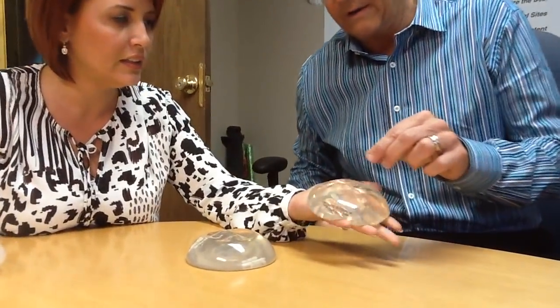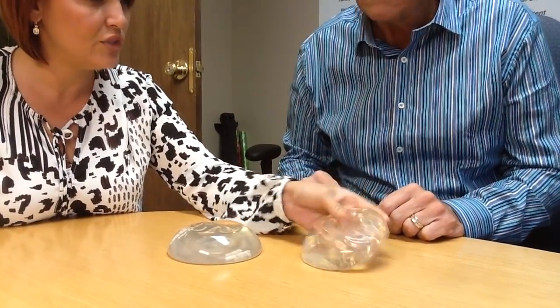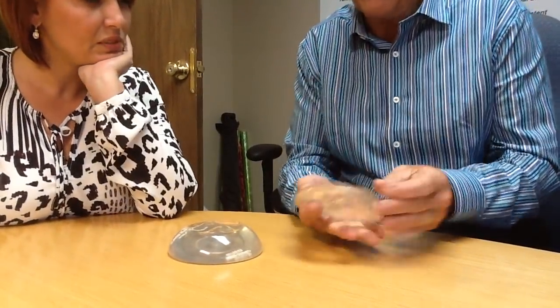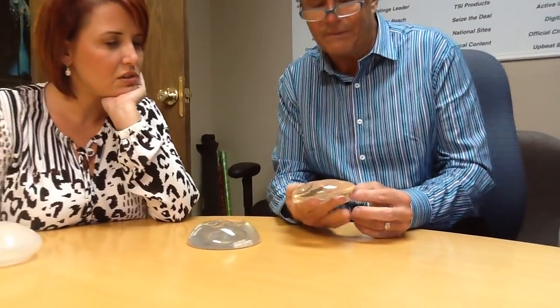Most people nowadays are still using saline, but more women are going to gel implants, which are also known as silicone implants. This is an older version — it feels gummy, kind of jelly-like. It's been around since the 90s. It has a silicone shell, and inside it has a silicone gel — a less cohesive gel.